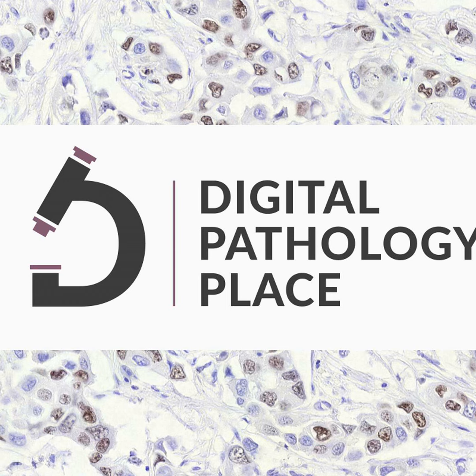Anyway, what they did here, they did imaging of pre-treatment and post-treatment biopsies. And I'm going to tell you what the intervention was. But they used a different method than just our standard H&E. They used harmonic generation 2-photon excitation fluorescence microscopy with AI image analysis.